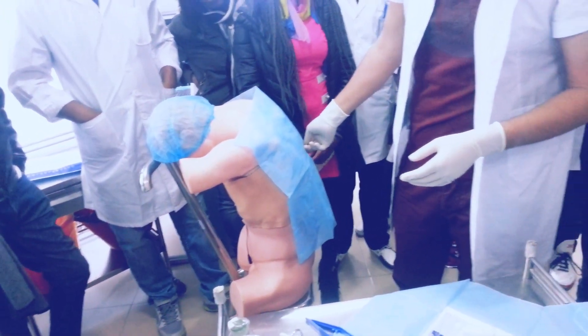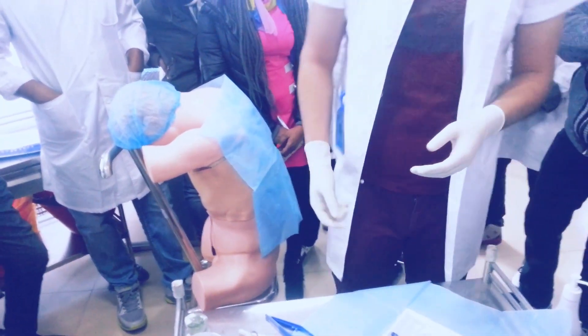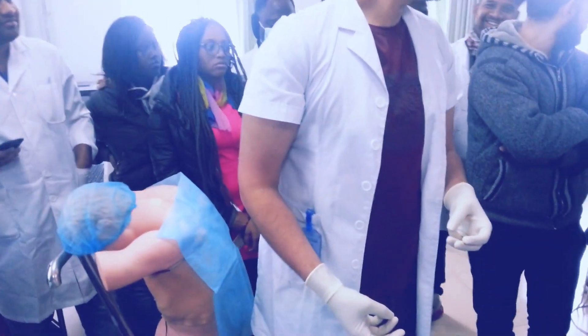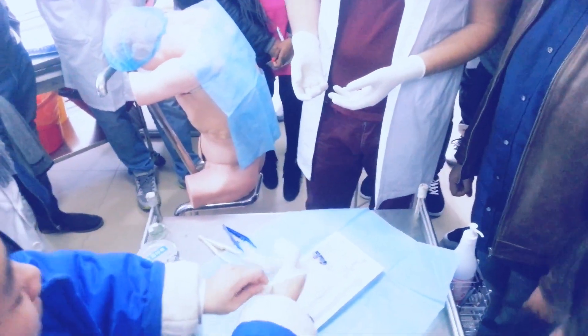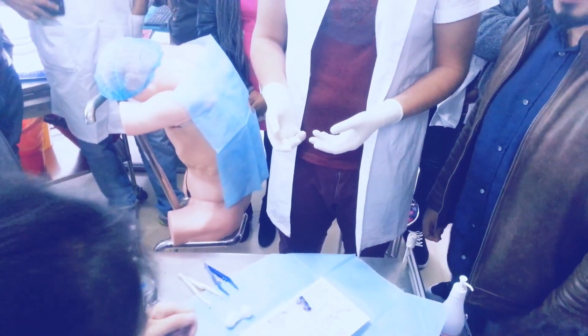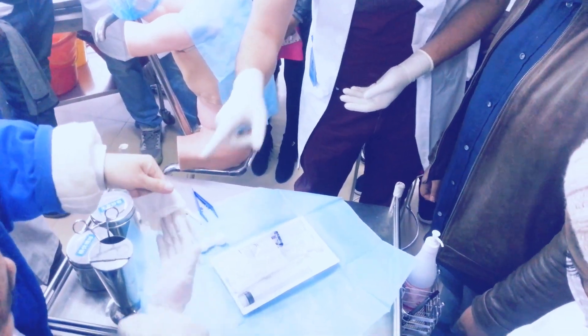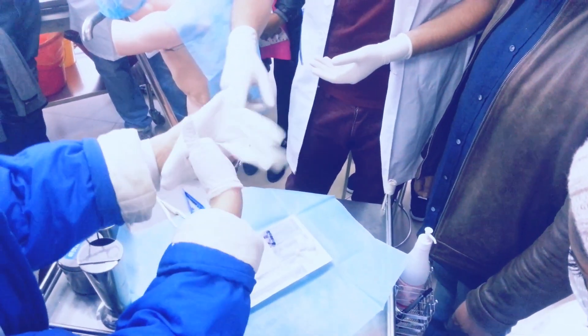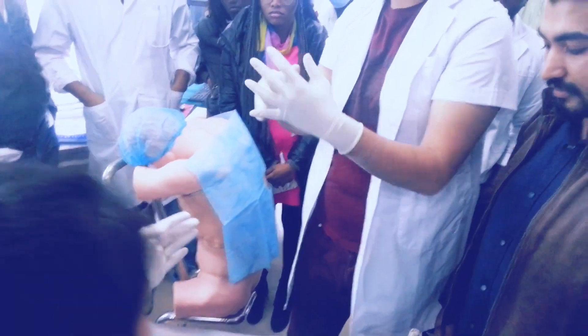Now I will anesthetize the patient. Assistant. The assistant will hold the gloves like this — I can do this because the other side is sterile. This side is the sterile side. When you are wearing gloves, you cannot touch the other side because that is the dirty side now. Non-sterile objects you cannot touch. And then you do this.